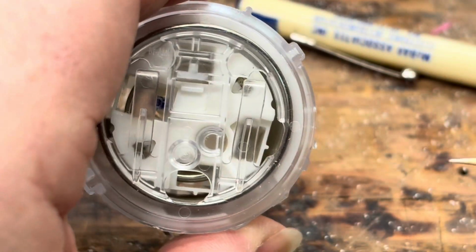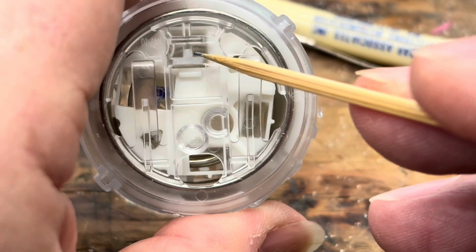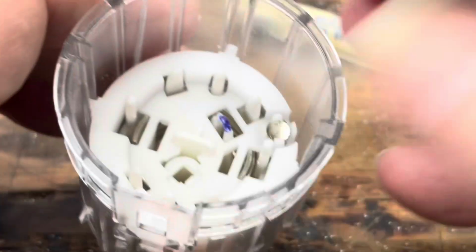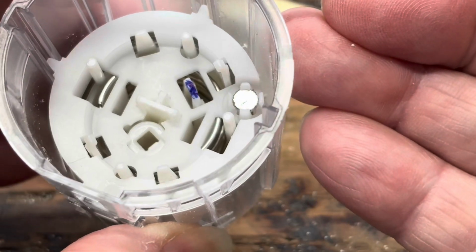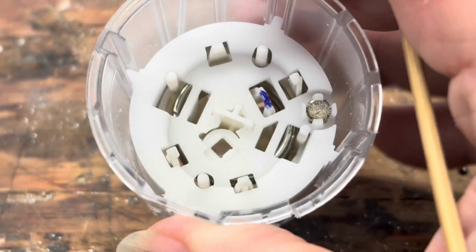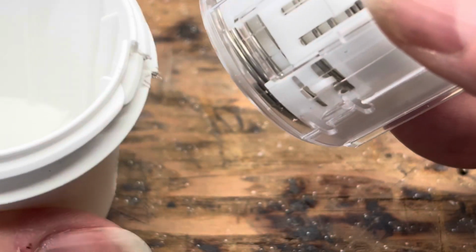And you can't see it very well, but right here is that arm in cup 2 that passes through cup 3, ready to hook that ledge on cup 4 when this 3-4 unit travels far enough. The hook on cup 2 arrests cup 4, releasing the spring between 3 and 4, so the needle retracts after it's inserted the probe in the user's arm.